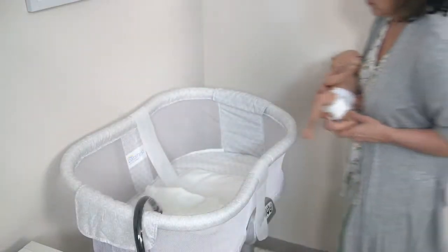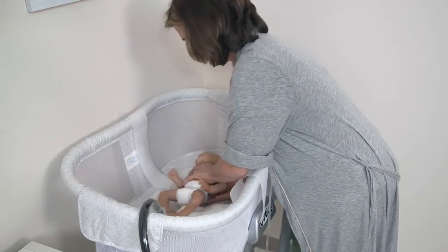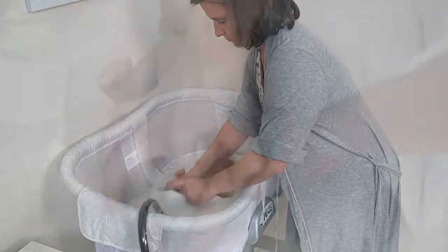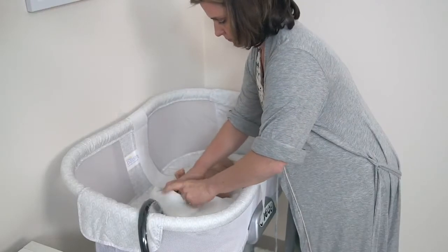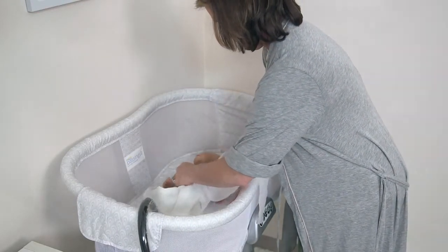For the nest cover, place the baby on the padded side of the nest. The straps are on the sides. The fiber optic cable is at the baby's feet. The foot roll is for the baby's feet, not the head. It is important to be sure to position the baby to expose the most amount of their skin to the pad light. The baby should wear a diaper only.